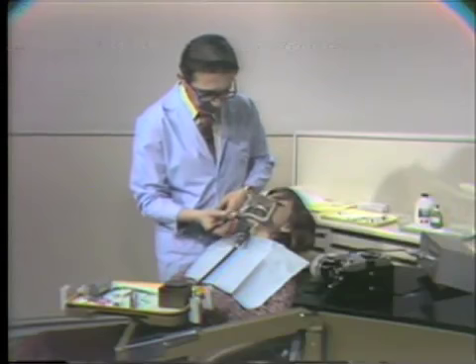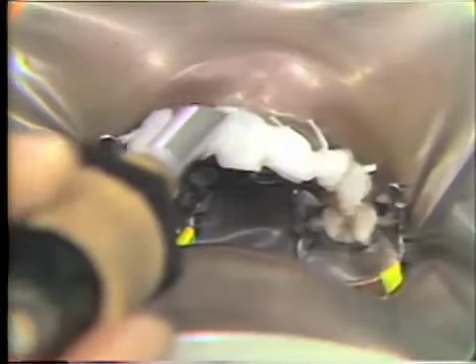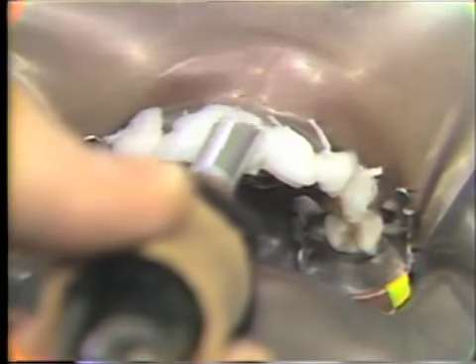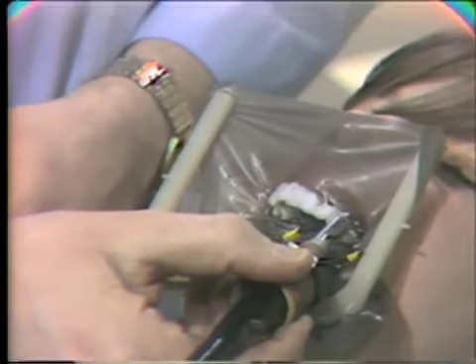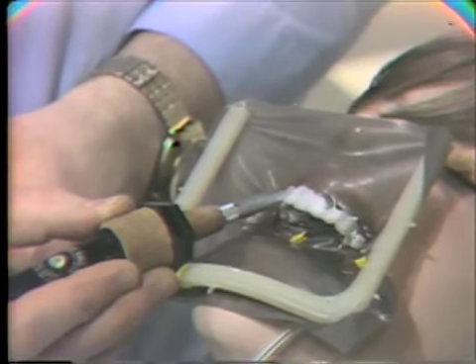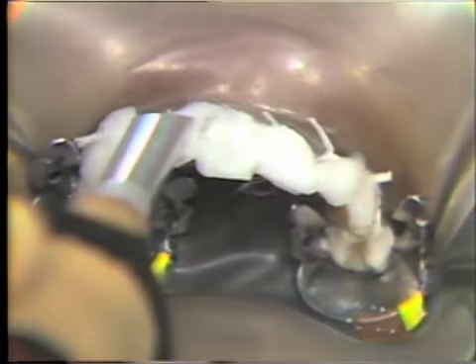Now I've got the agent on the cotton on each tooth. Now I will take the small iron and apply it to the labial surface of each tooth. What I like to do is move from tooth to tooth before we actually heat up the pulp too warm. Okay, here we are. We've made it around one side again. Again, if you feel anything, you just make a little bit of noise. Then we know we're getting too warm. Oh, she felt that one.